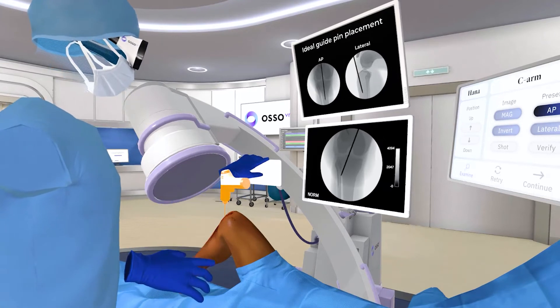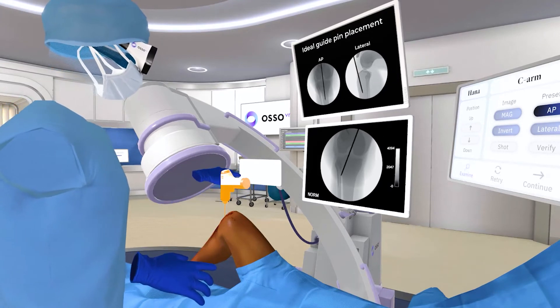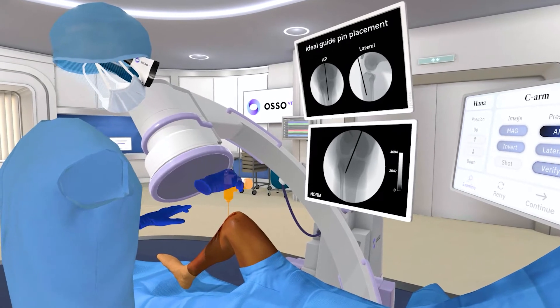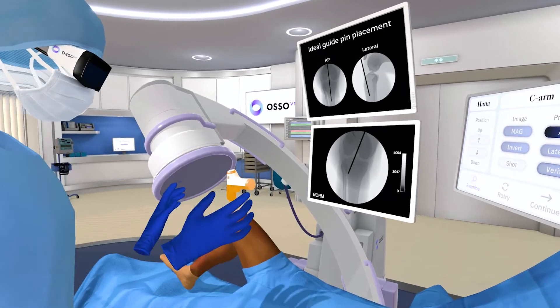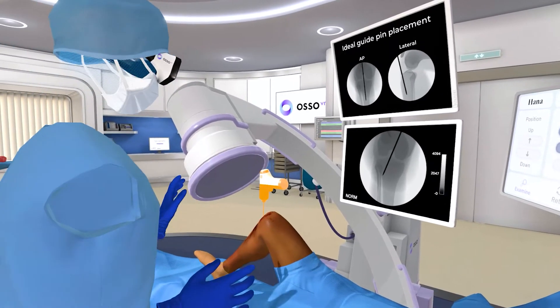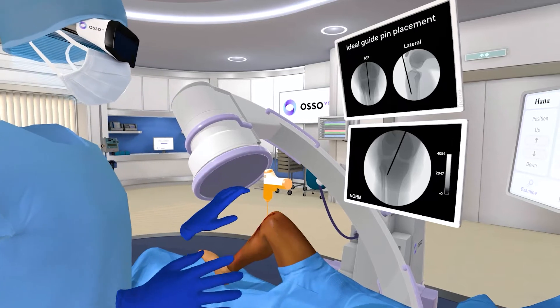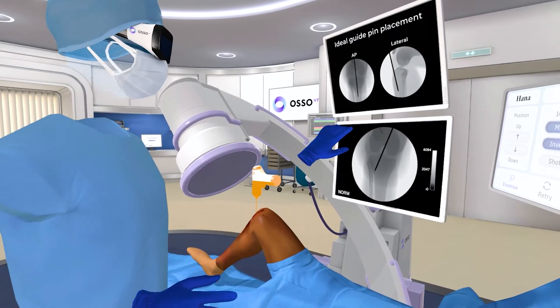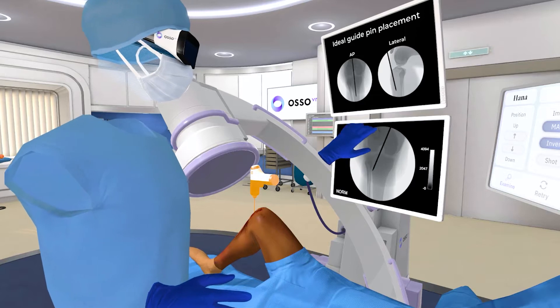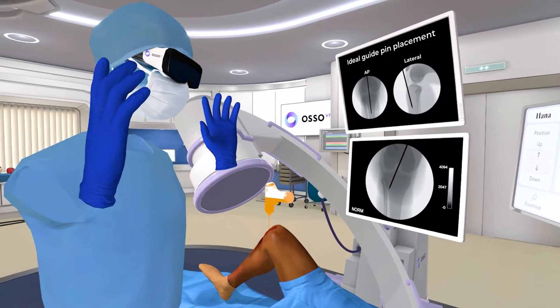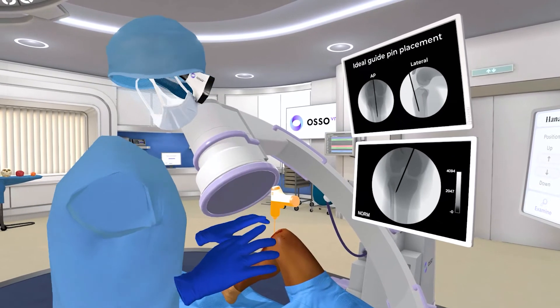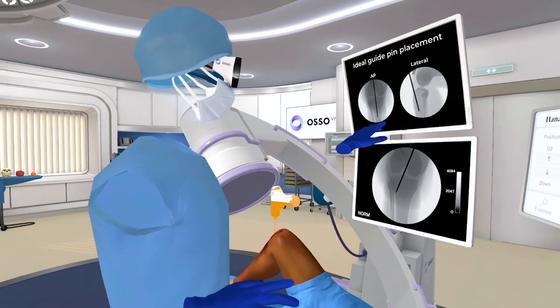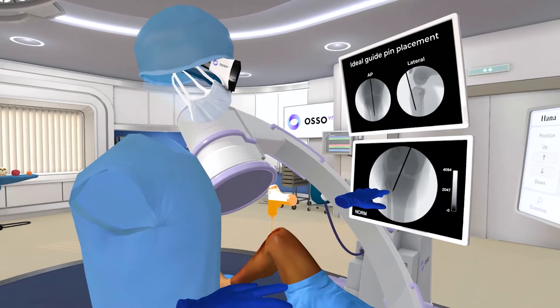We have little bonus flavor things — so if I'm exiting the bone here, I get a warning symbol to help keep people in the guidelines. Another really key skill is understanding how to interpret a 2D image and create a 3D mental model in your head. Right now, ideally, you want the wire going right down the center of the bone.